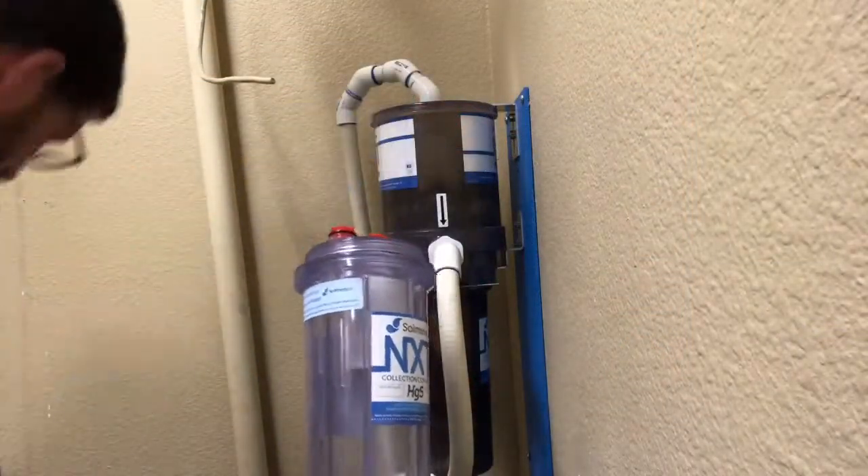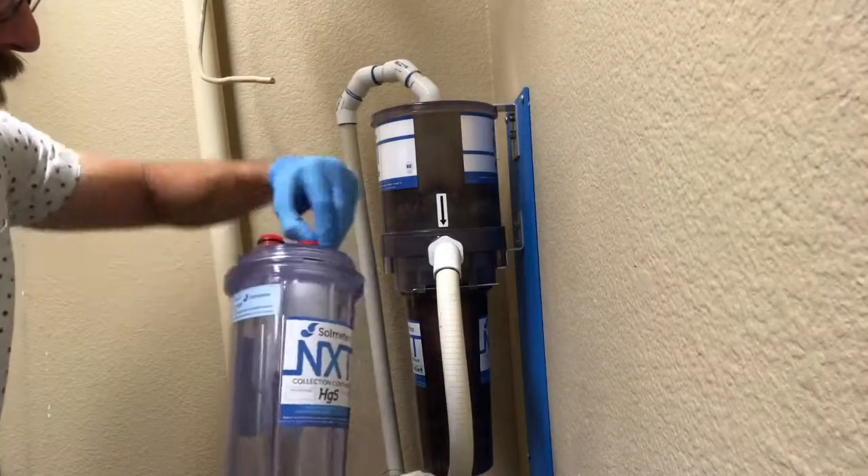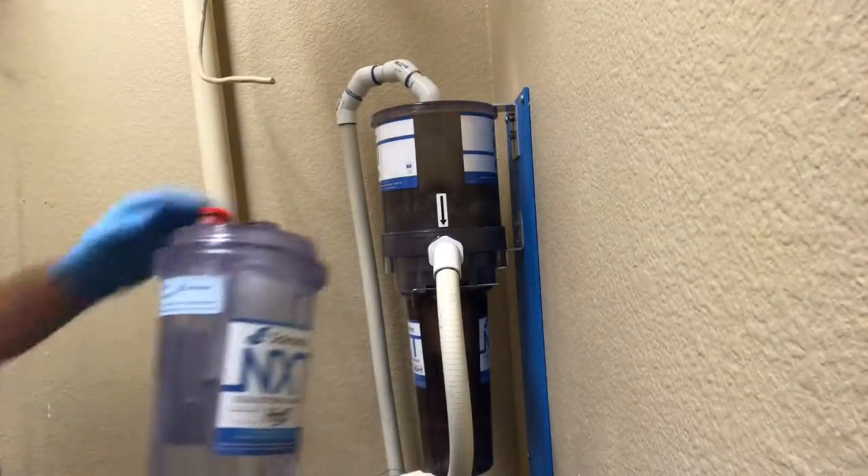First thing you're going to do is go ahead and unscrew this cap. You're going to remove these two red caps and set them aside because you're going to need them for later.